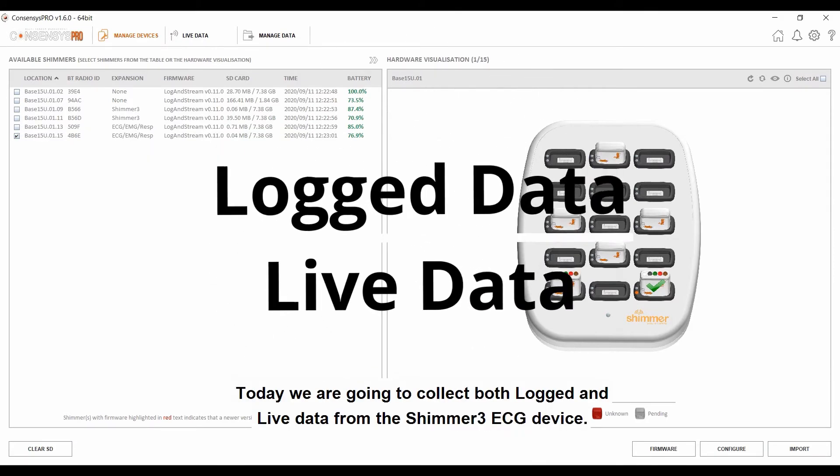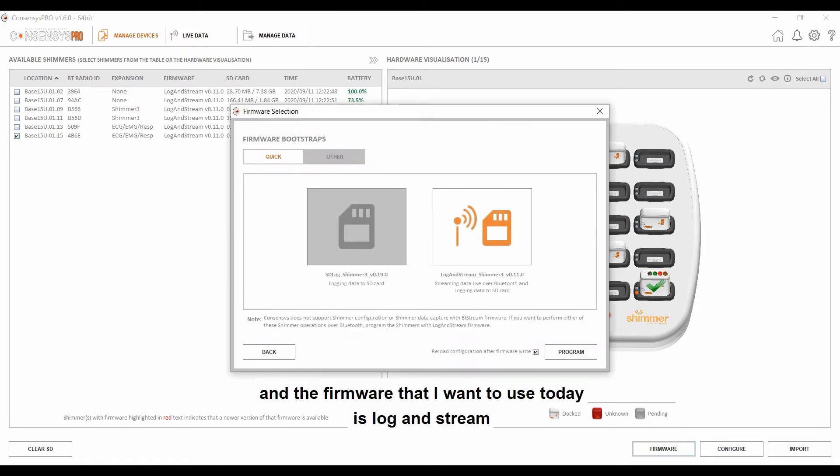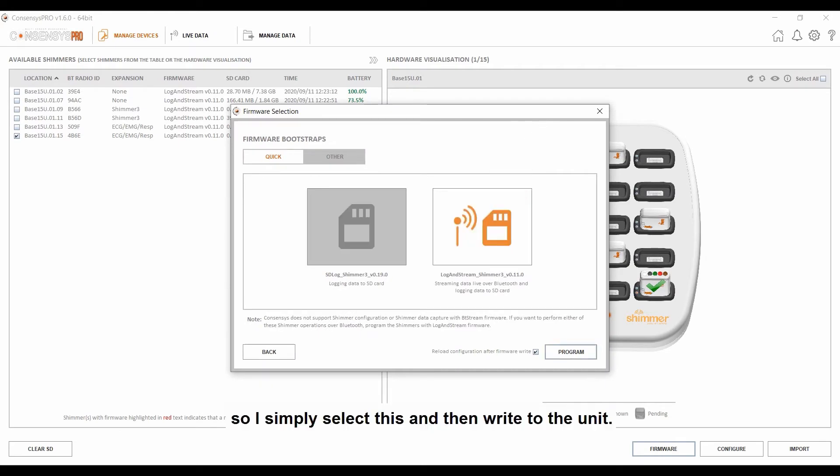Today, we are going to collect both logged and live data from the Shimmer 3 ECG device. The Shimmer 3 ECG has an inbuilt SD card for collecting data and also has Bluetooth capability for streaming data live. The first step in the data collection process is to ensure that the firmware is set correctly. I select the unit that I want to collect data from and then click the firmware. The firmware I want to use today is LogAndStream, so I simply select this and then write to the unit.